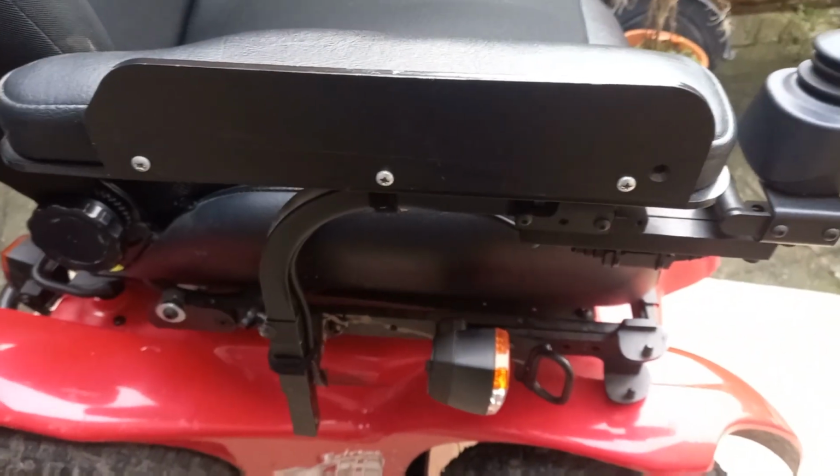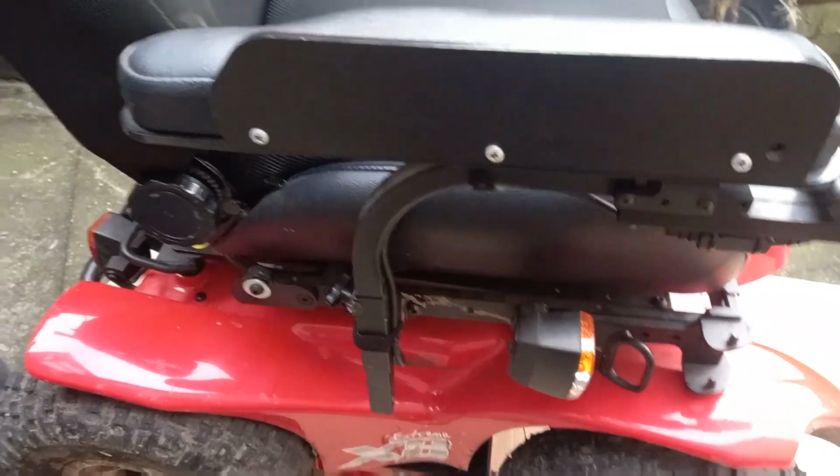Right, it's all done. We've checked the lights, indicators, and it works and everything. So yeah, team effort. There we go.